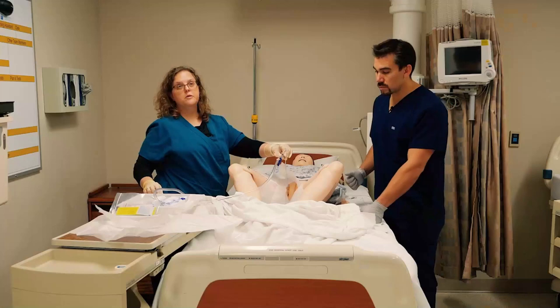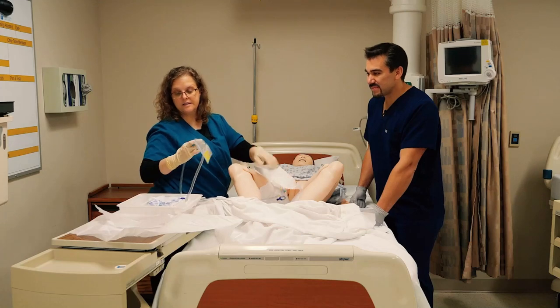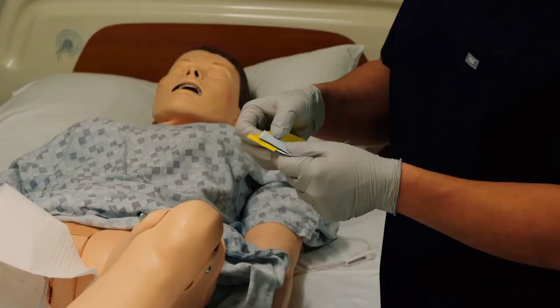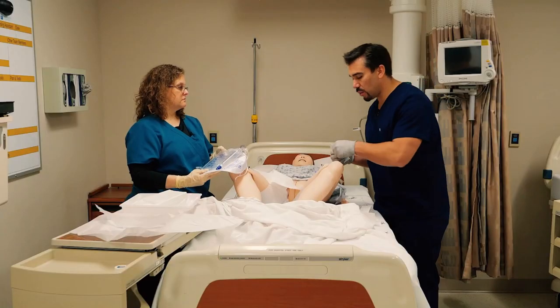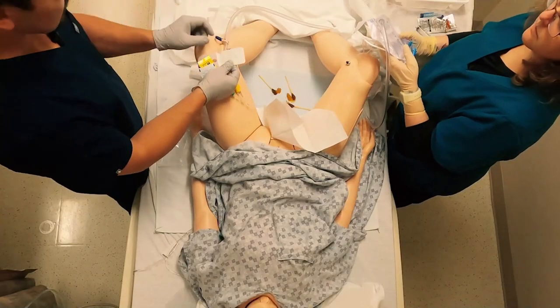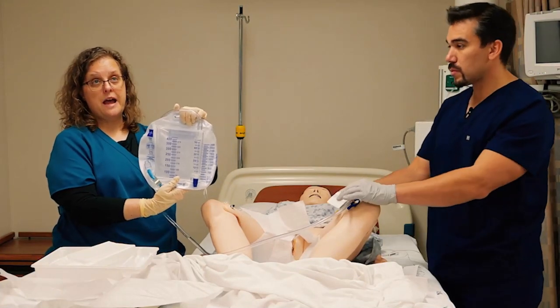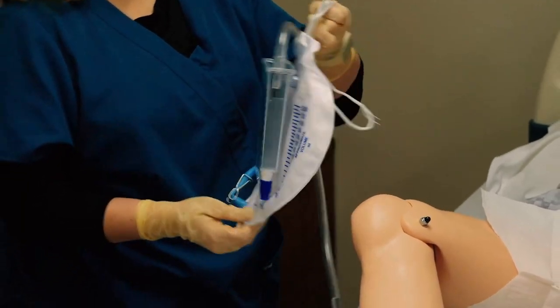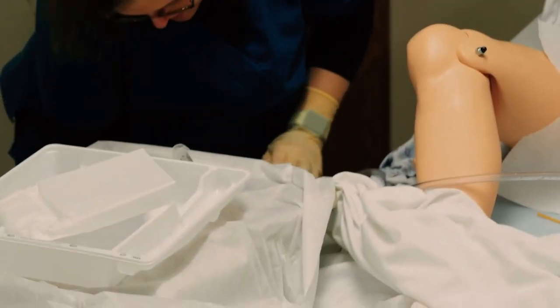We're starting to get a little bit more urine here, and her urine is super clear, which is awesome. Let's see if we've got the clamp to hold this thing in place — yes, we do. This handy clamp will hold the catheter in place on the leg so that it doesn't get yanked or pulled out. Sometimes you have just a bag, and sometimes you have a urine meter. If you're in an intensive care environment, you really have to have the meter — it lets you check urine output every hour. When this little box fills up, you can dump it back in the bag and don't have to empty it every single time.